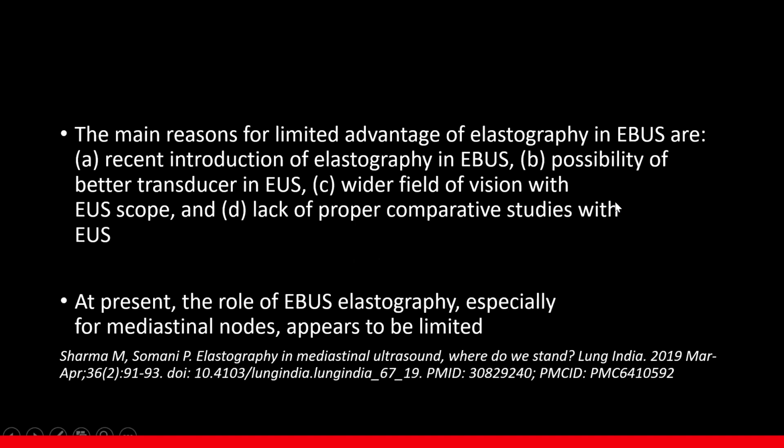Few studies are coming up in the last few years. The reasons for the disadvantage of elastography in EBUS are its recent introduction, better transducer in EUS, wider field of vision, and lack of studies. So at this moment, the role of EBUS elastography appears to be limited. However, further studies are coming.